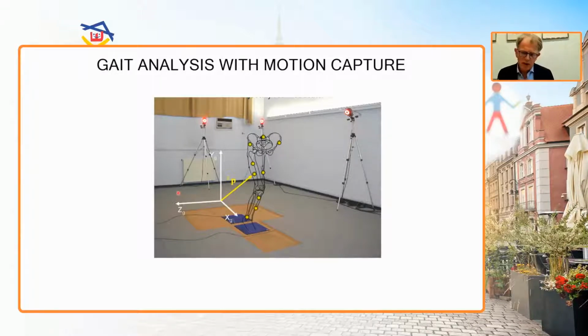But we must realize that although the equipment, especially over the last decades, has become very accurate and precise, it still measures the markers that are on the skin. And the skin can move to some extent with respect to the underlying bones.